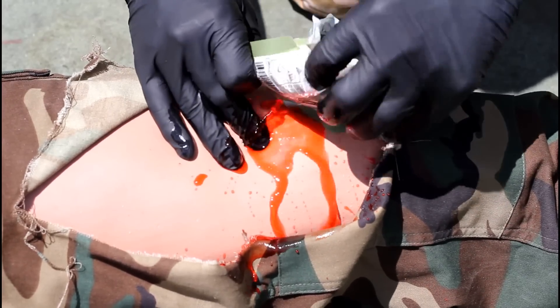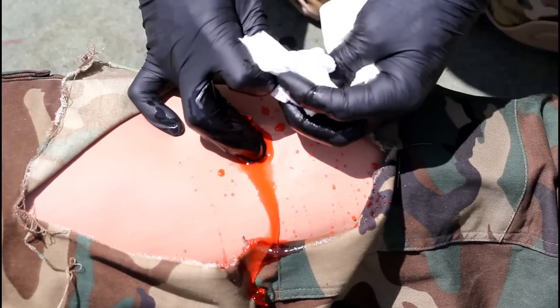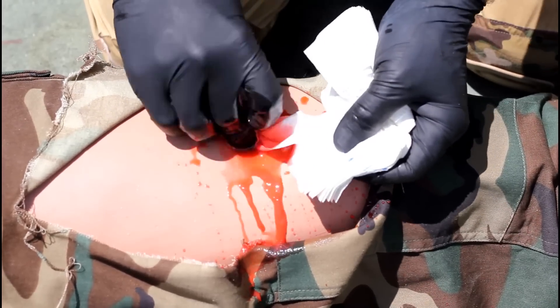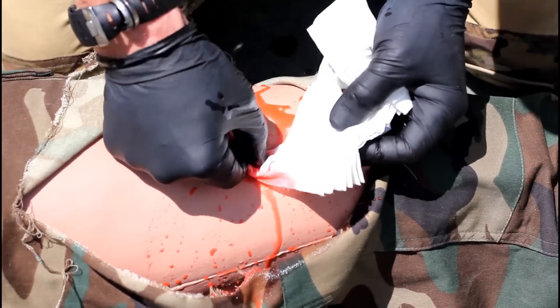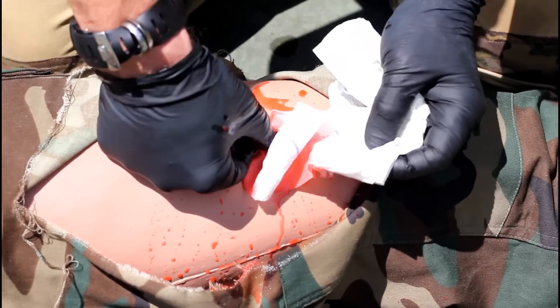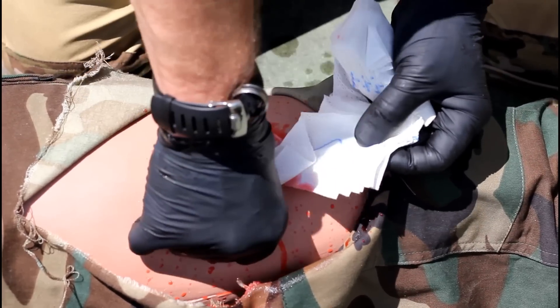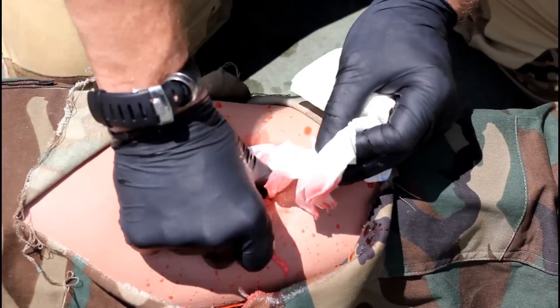As discussed in the directions for use videos, the key to successful use of combat gauze is to pack the gauze into the wound deeply so that it comes into contact with the source of bleeding. You must also pack enough gauze into the wound to completely fill any open space. A large wound might require you to use more than one combat gauze. Don't forget to check for an exit wound or additional wounds.